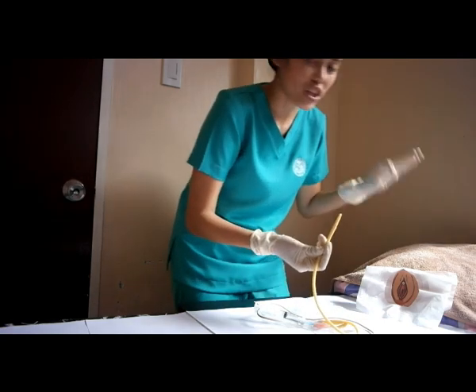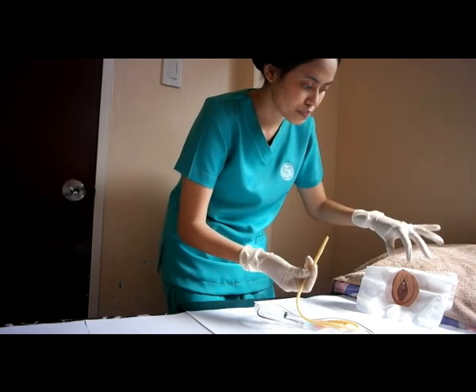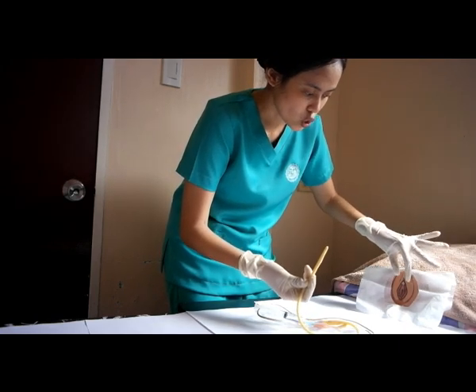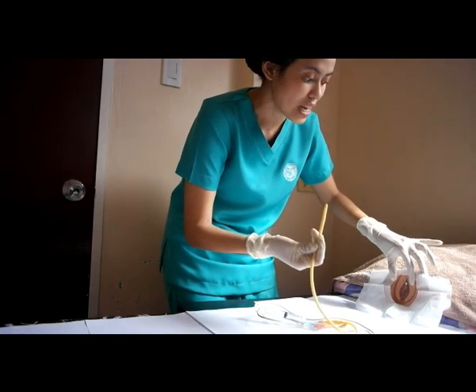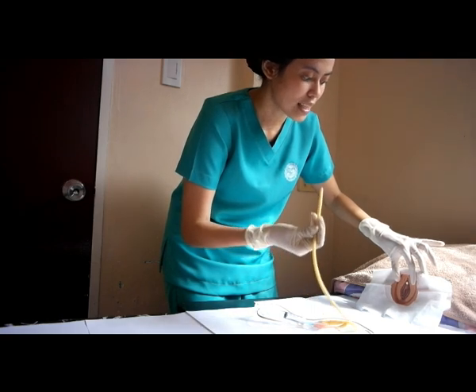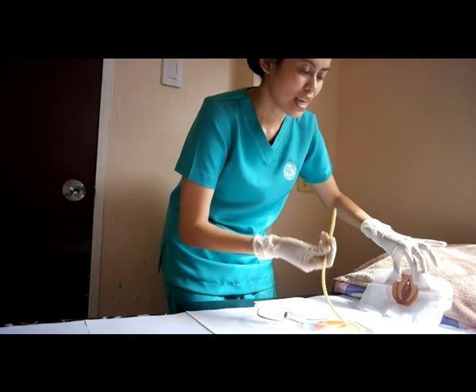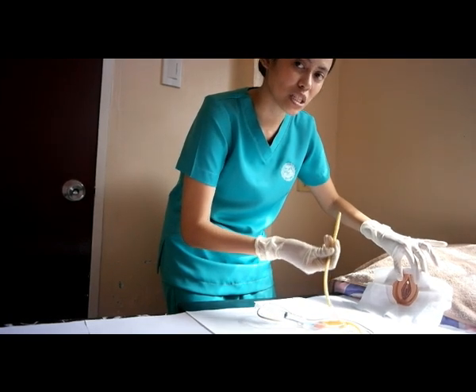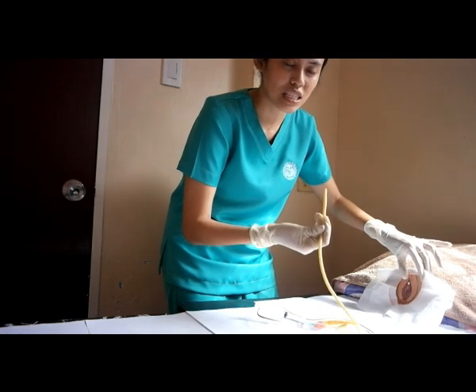So with your non-dominant hand, we're going to use that to still spread the labia, to expose the urethra, and to properly insert the catheter in the urethra. So this is the time when we will now be instructing the patient to inhale and exhale. As she inhales, it serves as a distraction, and as she exhales, that's the time when we insert the catheter.